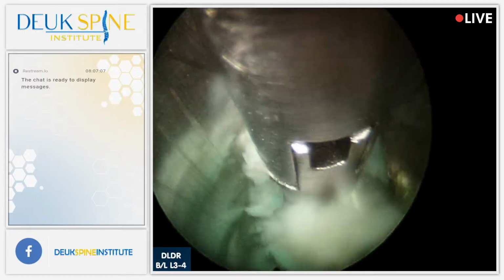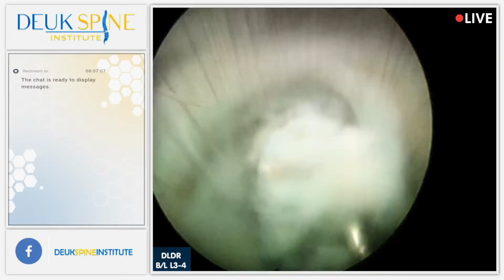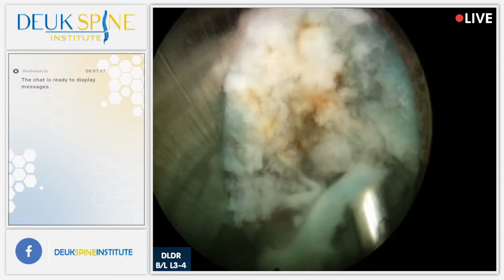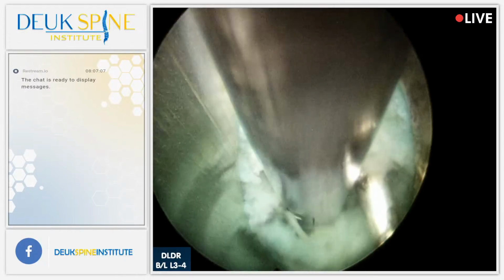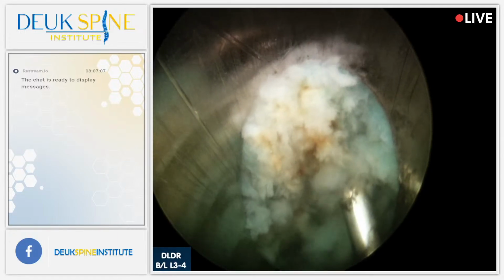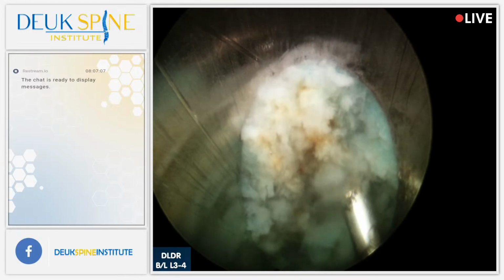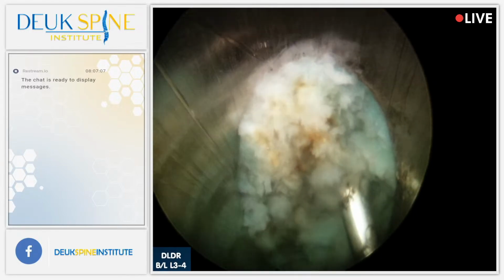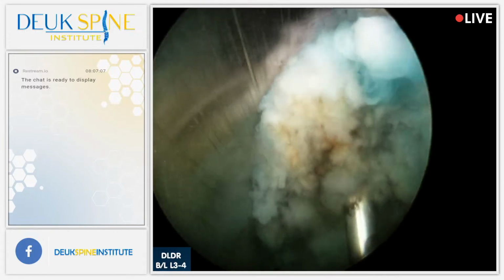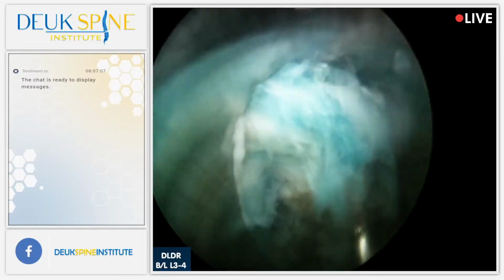So people ask me, Dr. Duke, can lasers remove bone spurs? Of course they can. They can melt steel. Steel is harder than a bone spur. So can a laser be used to remove bone spurs that are necessary to remove? Absolutely. Does that mean we're going to remove all the bone spurs? No. Why? Because most bone spurs don't need to be removed.